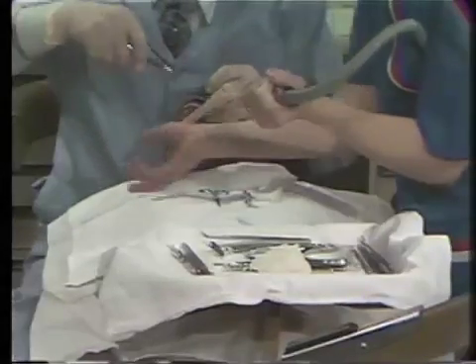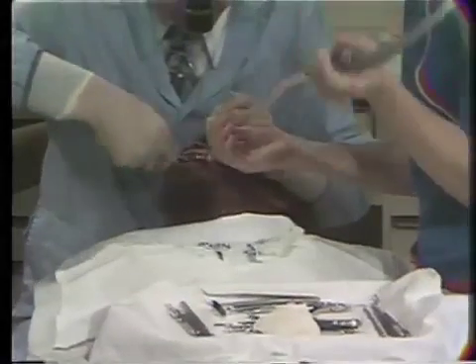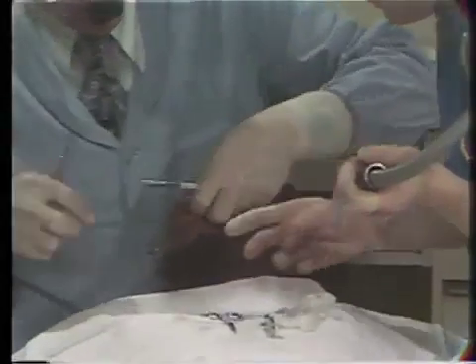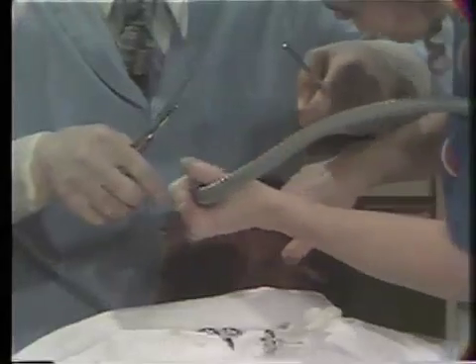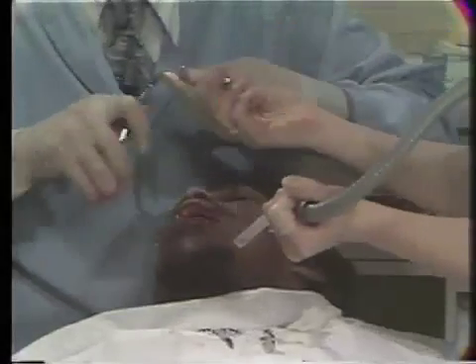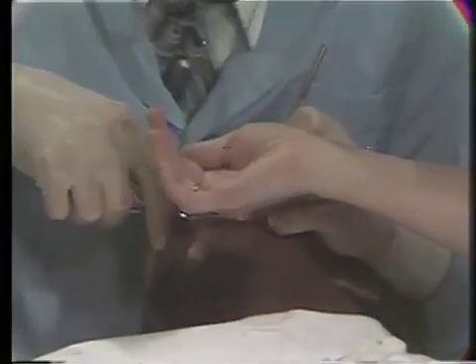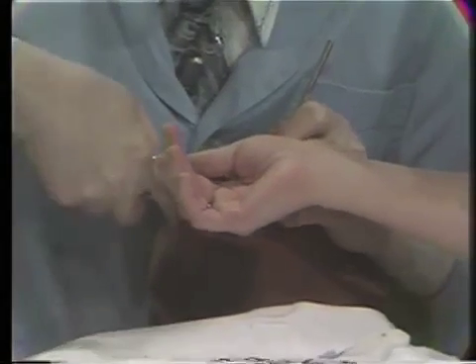We don't always have a mustache and a beard to work around, but if we do, we just work around it, and you can see how she holds the suture up and away from the mesial facial. There you go. Hang on just a minute. Now hold it. How you doing, Harry? You can see him nodding his head, so Betty must be doing a good job of assisting since we're proceeding well.